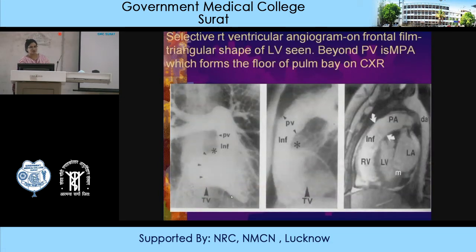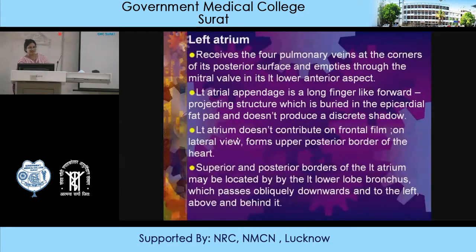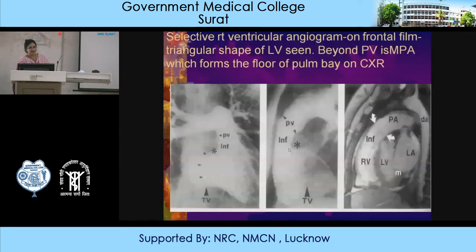On the frontal view of a selective right ventricular angiogram, the triangular shape of the right ventricle is seen. Beyond the pulmonary valve is the MPA, which forms the floor of the pulmonary bay on the chest X-ray. On the lateral view, you can see that the right ventricle forms the anterior-most aspect of the heart and gives rise to the pulmonary artery.